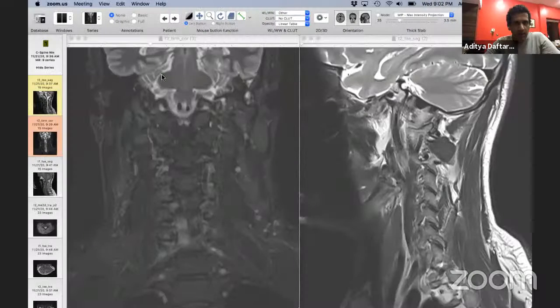It's an interactive session, mind you. We'll start off with about 10-15 minutes of Dr. Aditya's presentation on how to read a normal MR and follow it up with specific pathologies where we'll have our fellows first run through that specific pathology and inputs from the faculty thereafter. So without wasting any more time, can I invite Aditya to share his screen and start his talk on normal MR. Hey, hi, thanks everybody.